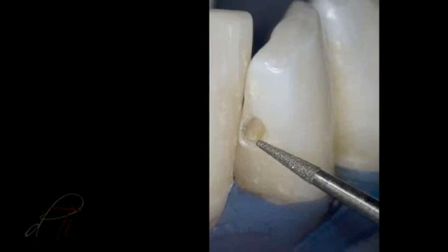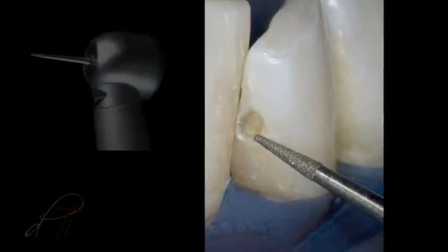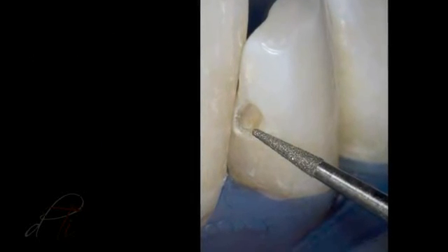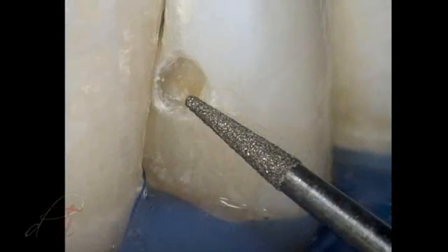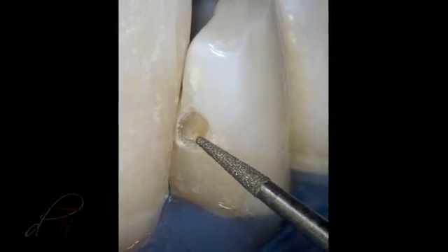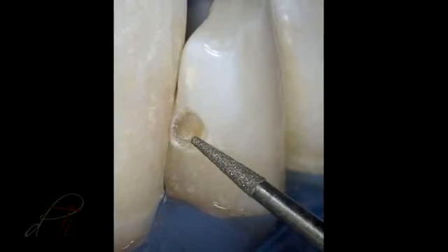A circumferential bevel is placed in enamel using a tapered diamond burr, a DET3 by Brassler USA. An enamel bevel is indicated because it increases the surface area for end-on etching of the enamel rods, resulting in a stronger enamel-to-resin bond, which increases retention of the restoration and reduces marginal leakage and discoloration.